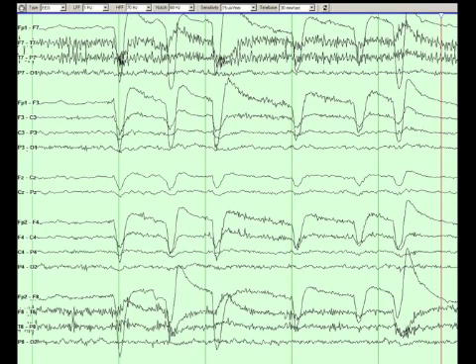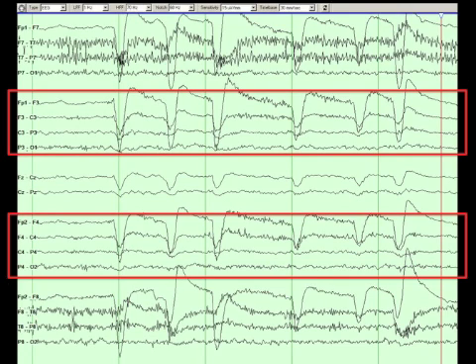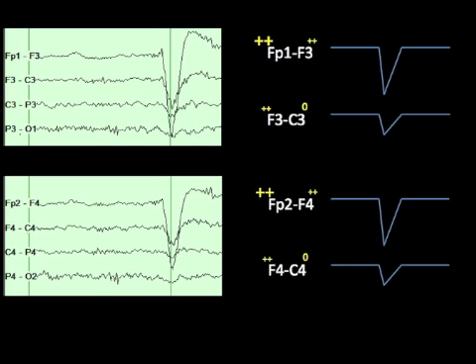Our suspicions are confirmed when we look at a normal EEG in which a patient is blinking his eyes. If we take a more careful look at the electrodes that we have predicted the outcome, we see that our predictions are accurate.